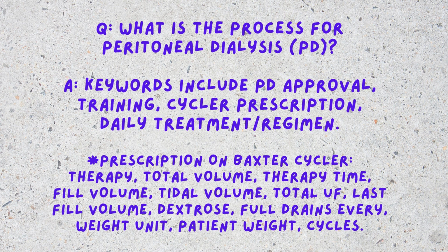Now, you may also have a partner, a spouse that is also a support system and does this training with you to help you connect and disconnect and stuff like that. So you have people that do that. Maybe they have caregivers, they have spouses, maybe they are older or something like that. As long as you or someone else that is with you every day is able to take responsibility for that, and health wise you are a good candidate, then yes, peritoneal dialysis may be a good option for you.